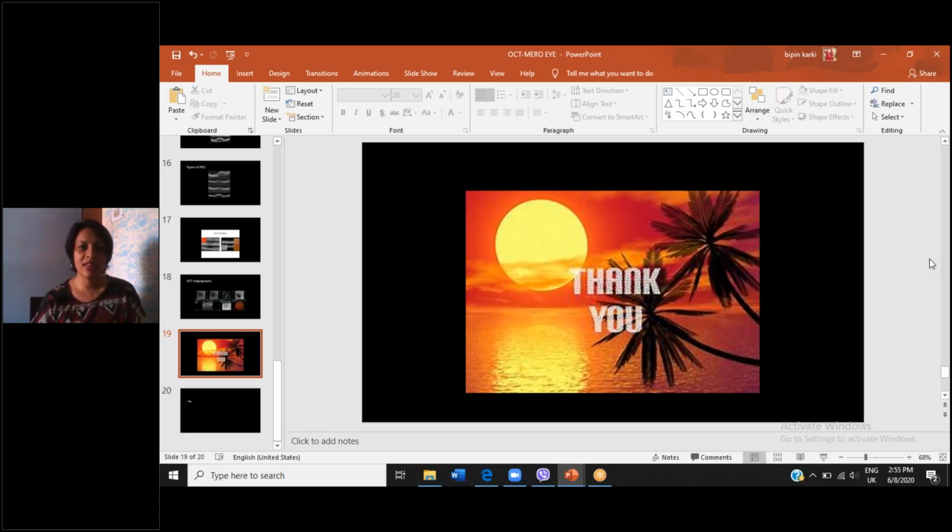Yeah. So autofluorescence these days is very helpful. It is non-invasive and it gives us more idea than just the fundus photograph or infrared picture of the retina. Without an injection of any dye, if there are fluorophores or fluorescing material at the level of the retinal pigment epithelium or even above that, those substances fluoresce and give us the autofluorescence. This technique has been very helpful in diagnosing different kinds of drusen, at which level the drusen are. In various choroidal diseases like choroiditis, we can delineate the outline of the choroidal lesions and see if they autofluoresce or not, and that's how we can know the activity of the disease.